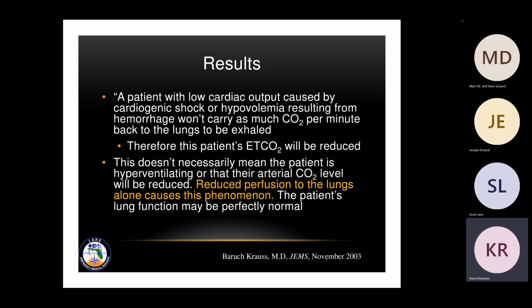This does not necessarily mean that the patient is hyperventilating or that the arterial CO2 level is being reduced. Reduced perfusion to the lungs alone causes this phenomenon. The patient's lung function may be perfectly normal. So this is why it's important, even with trauma patients, to put them on oxygen. If you do a nasal cannula, just monitor them with the end tidal.